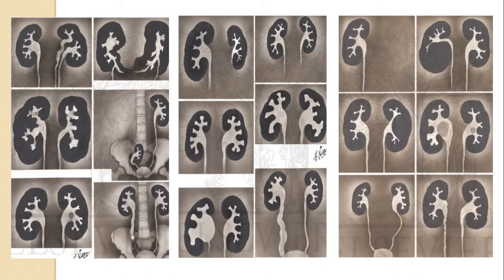This is a compound system with a small narrowing at the PUJ. Again, small atrophic kidneys, compound calyceal systems. This is a primary megaureter, an absent kidney, and a mass that deviates the right calyceal system and ureter.